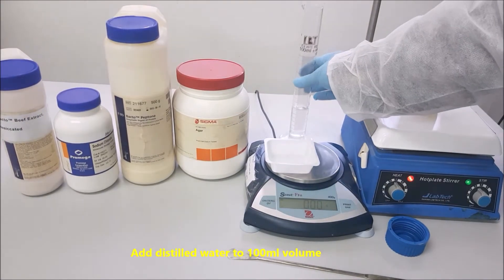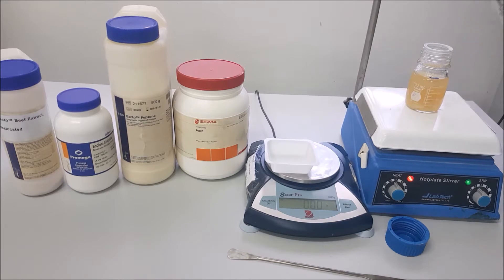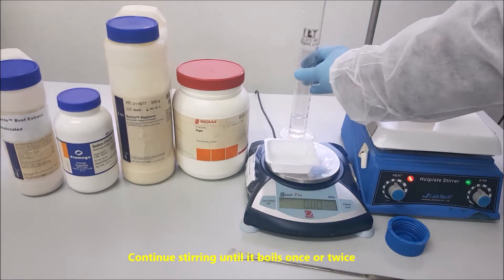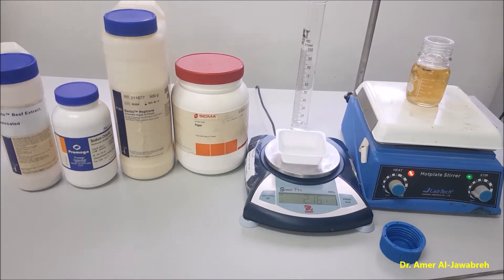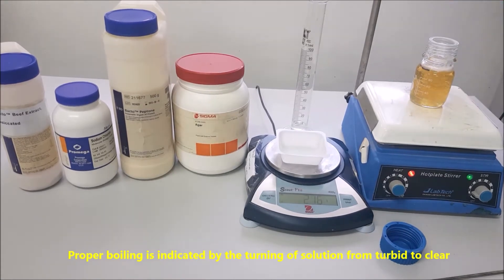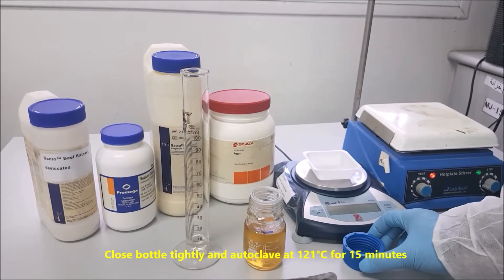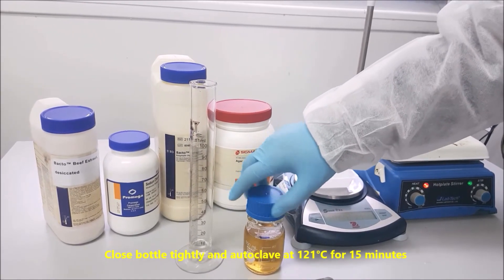Add distilled water to 100 ml volume. Continue stirring until it boils once or twice. Proper boiling is indicated by the turning of the solution from turbid to clear. Close the bottle tightly and autoclave at 121 degrees centigrade for 15 minutes.